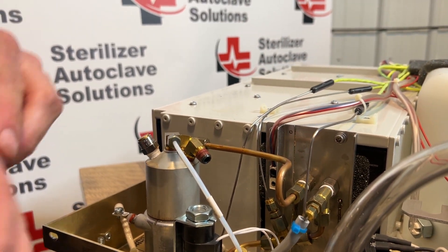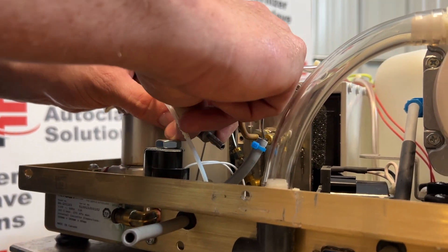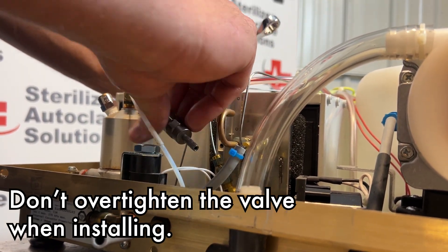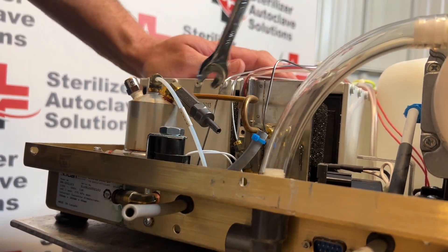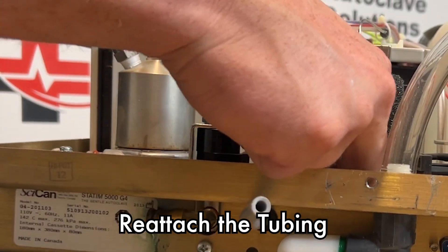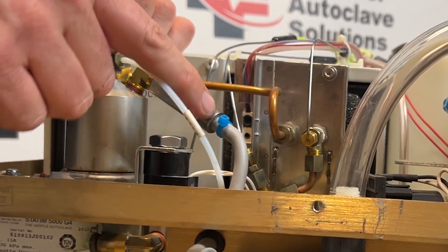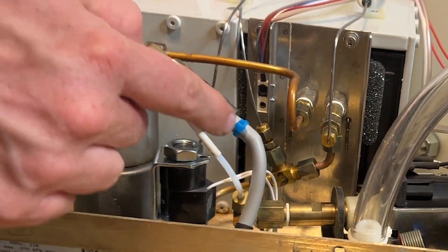Our new one will go right back on, and when you tighten this down it does not need to be torqued on, but you do want it to be firm. We do want to reattach our tube to our check valve. The new check valve does come with a new zip tie; however, I did not change this check valve as it is brand new.